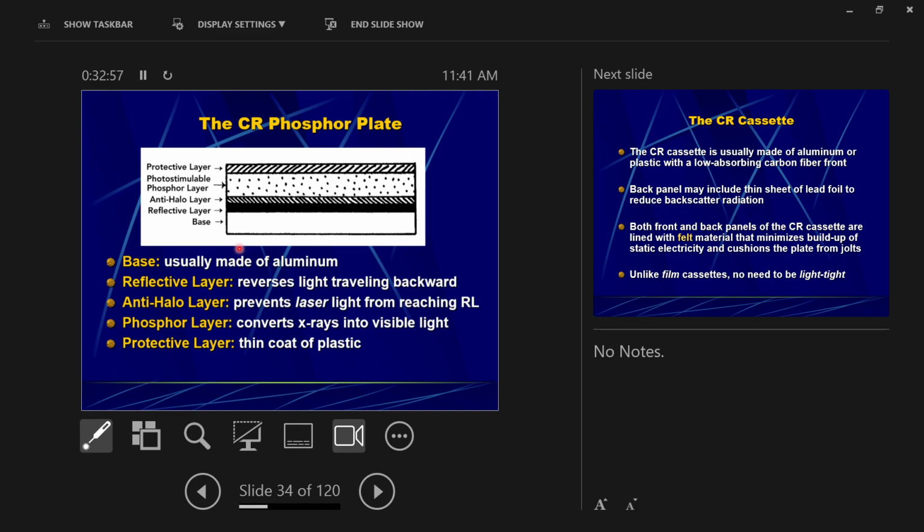So these have a usable lifespan, a year or two in busy offices. These are good for maybe 3,000 to 5,000 exposures, and you may make 3,000 to 5,000 exposures easily on this plate over a year's time, even if you have a few of these. So they have a usable life. What's nice is this is easy to buy and replace, and you just put a new one in here.